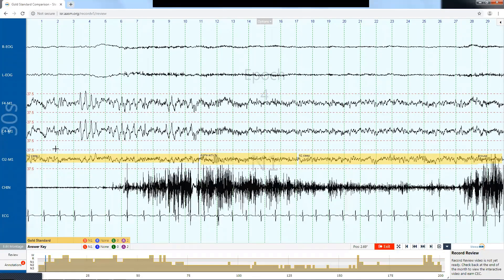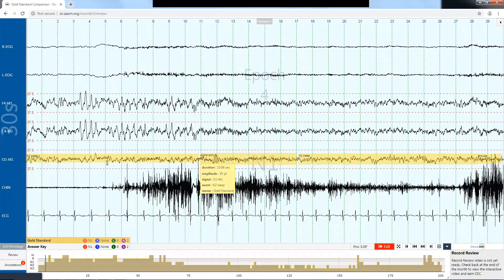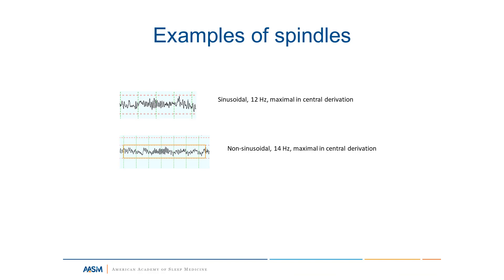In epoch 4 we have N2 sleep, then some alpha activity which is basically an arousal, then the frequency decreases back to N1, and then another arousal at the end — so two arousals in this epoch and an overall stage of N1. Here are some examples of spindles: a sinusoidal approximately 12 hertz frequency that starts low amplitude, increases, then tapers off, and a non-sinusoidal 14 hertz spindle — all maximal in the central derivation.